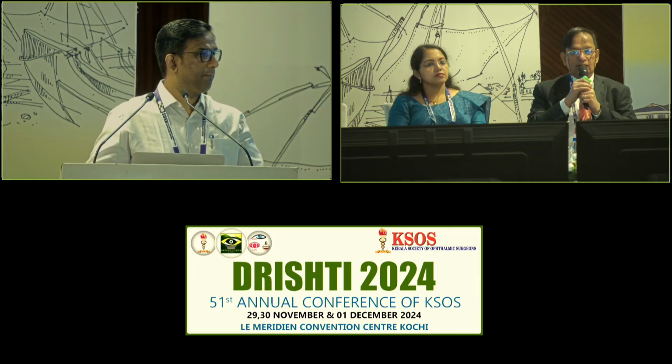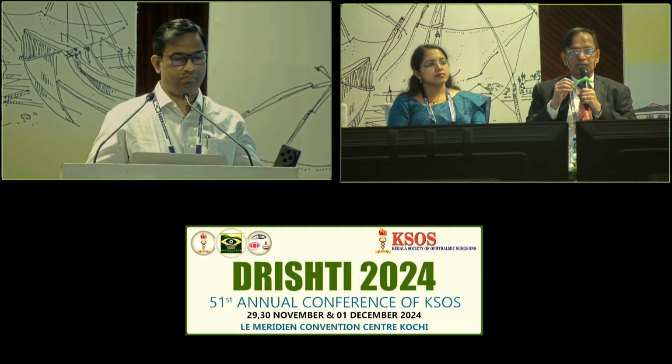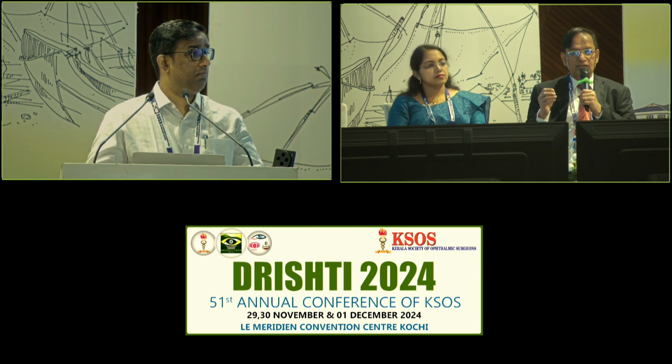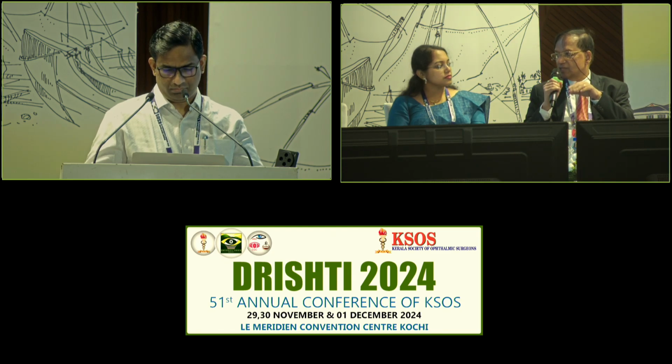Number two, if you don't have Viscoat and you cannot afford it, it's a cam case and so on, then what I do is, as we are doing the rhexis with a capsulotome, connect the capsulotome with the 2cc syringe with methyl cellulose, that is Uppervisc or something, and then keep injecting. Do you do that, Dr. Leena? Do you inject the visco into the chamber as you're doing the rhexis?